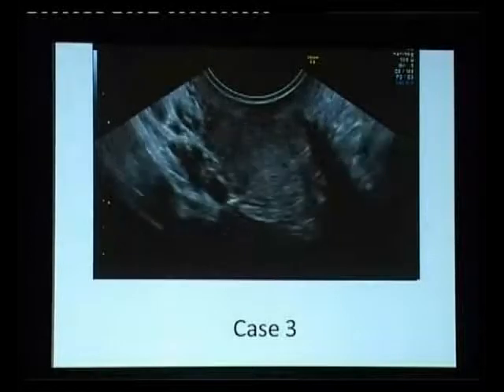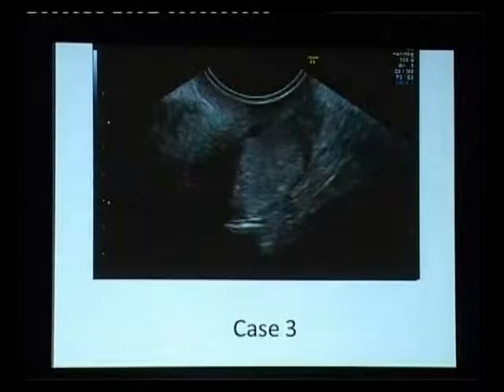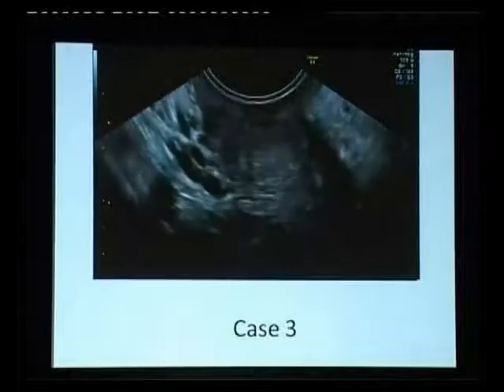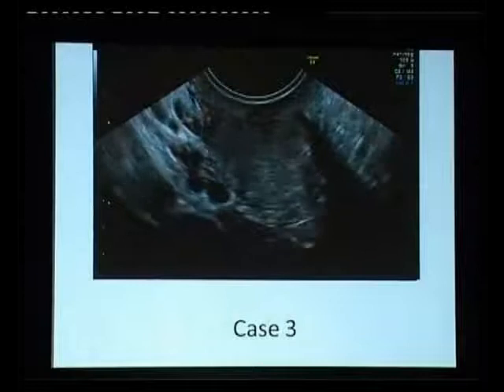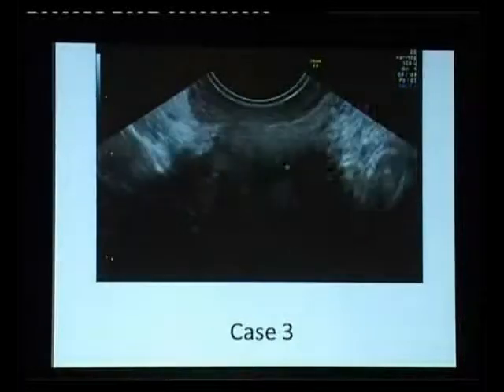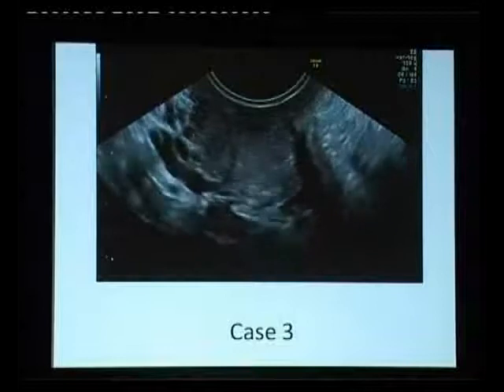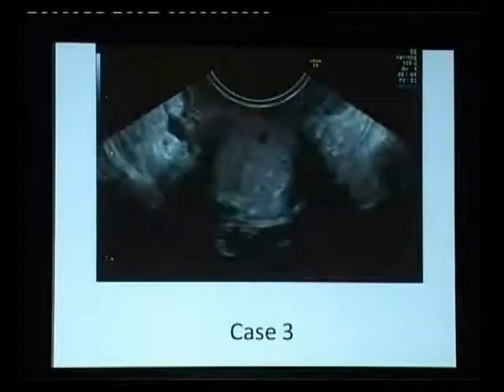here you can see that it seems to be irregular. You cannot see anything here and nothing there, but when you go over to the transversal section, we wait once more, you can see that this is clearly irregular here. So, this is another slide. It is irregular here. So this is not rocket science.